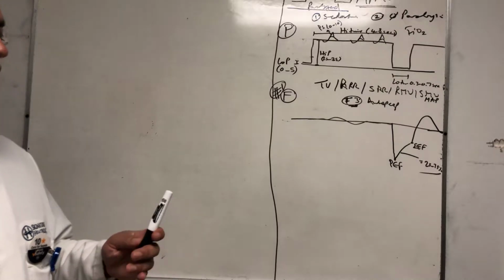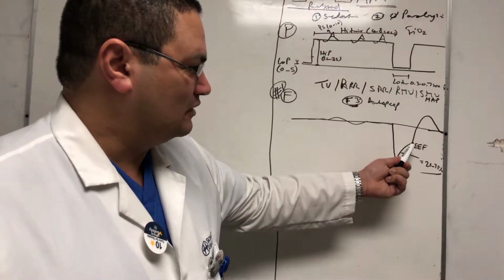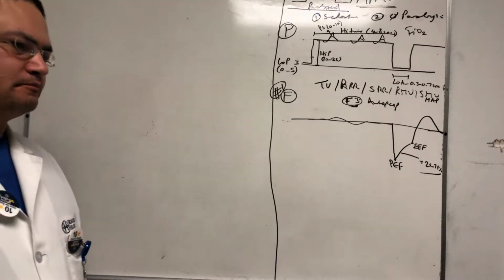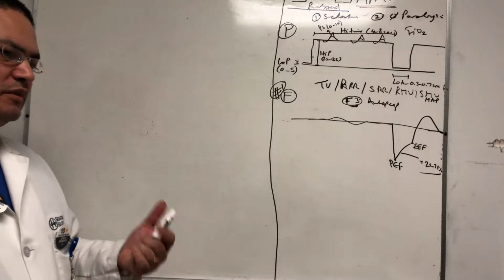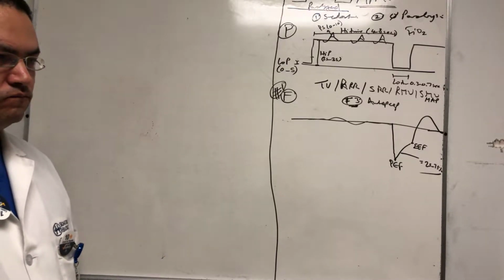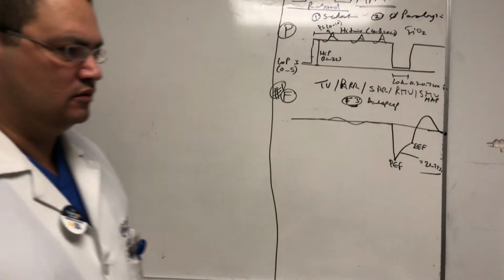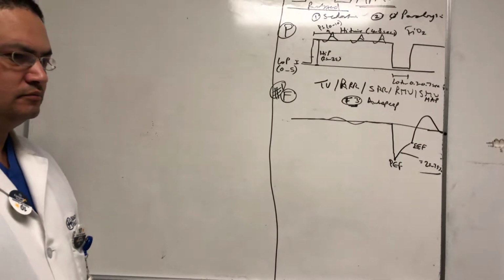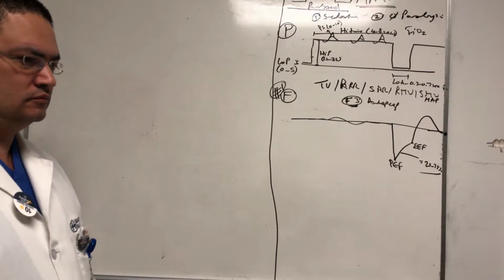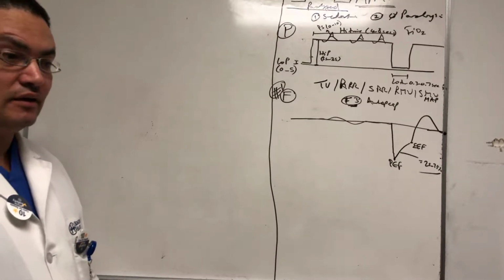So Professor Megan O'Connor, what if the ratio is 85%? What does that mean, what's going to happen to the patient, and what do you do? This is the end expiratory flow divided by the peak expiratory flow. So basically, if it's high, that means what?